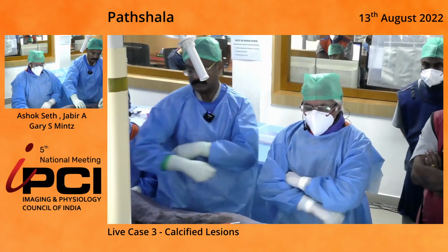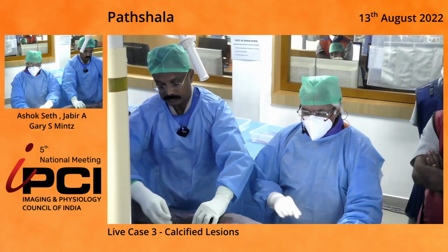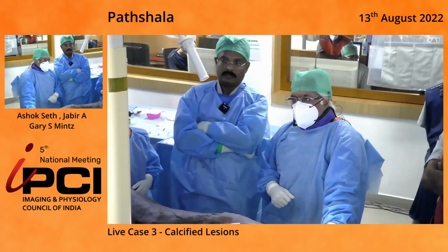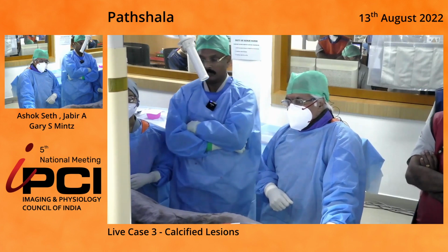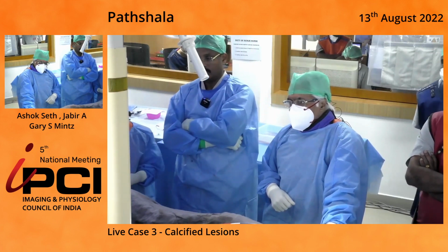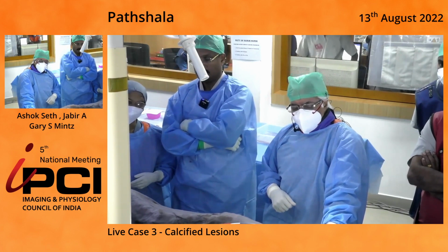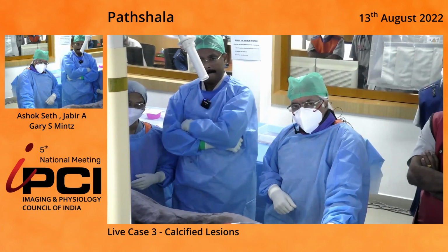Agreed. I think there potentially could be a hypercoagulable state, but at least mechanistically, we see that there's an underexpanded stent that hasn't expanded. So, if it looks like a duck and quacks like a duck, it probably is a duck. So I think it's probably related to the mechanical aspects, but I don't think that's unreasonable. And the other question I have is the potential use of laser in a case like this.